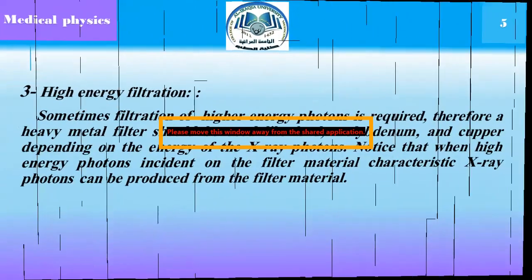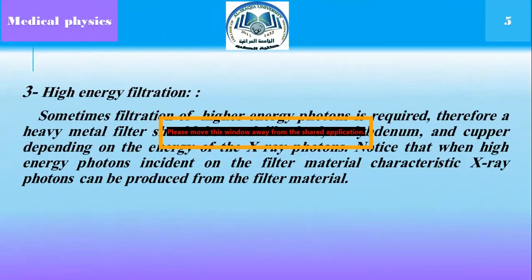Three, high energy filtration. Sometimes filtration of higher energy photons is required. Therefore, a heavy metal filter should be used, like lead, molybdenum, and copper, depending on the energy of the X-ray photons.